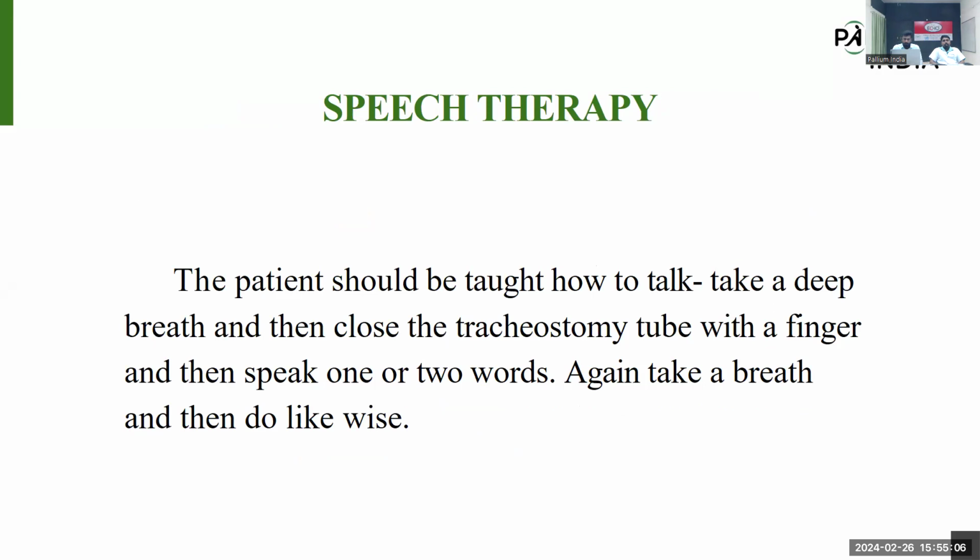Take a normal deep breath, then close the tracheostomy tube with the finger. Then they can practice by spelling word by word. According to the breath holding capacity, they can spell sentence by sentence. As a part of the speech therapy, they can practice and continue speech even if the patient has the tracheostomy tube.